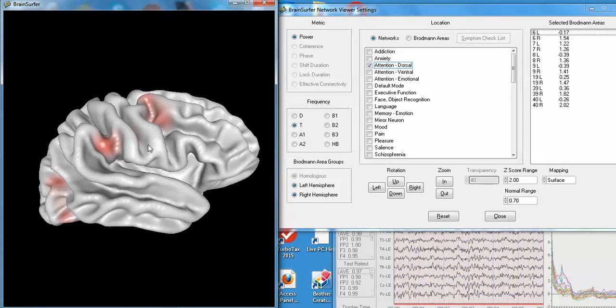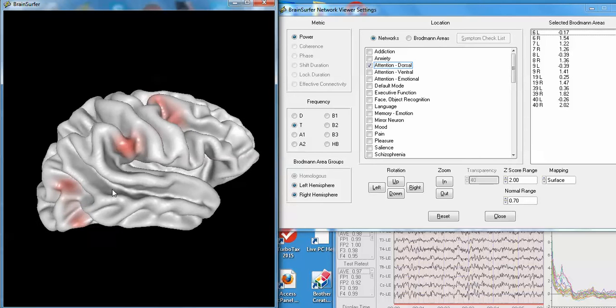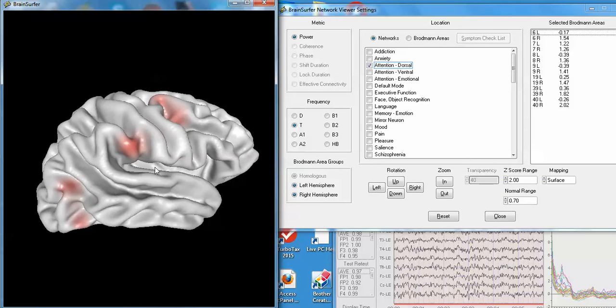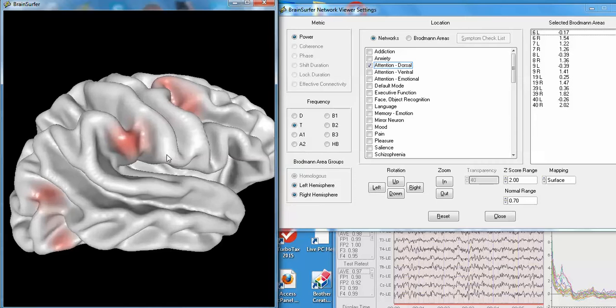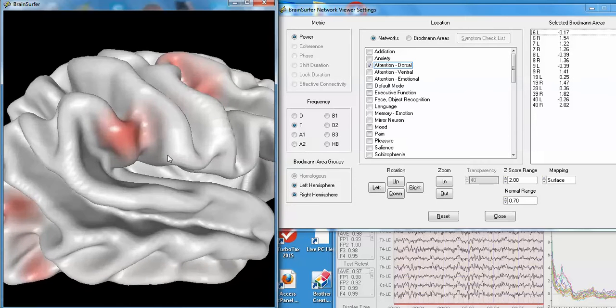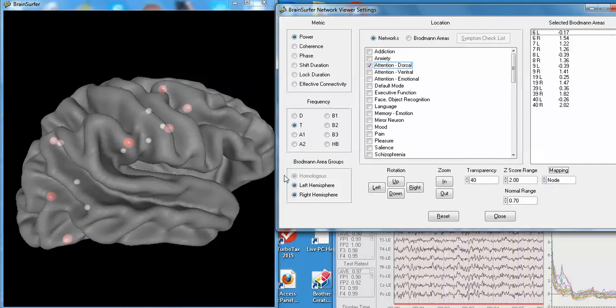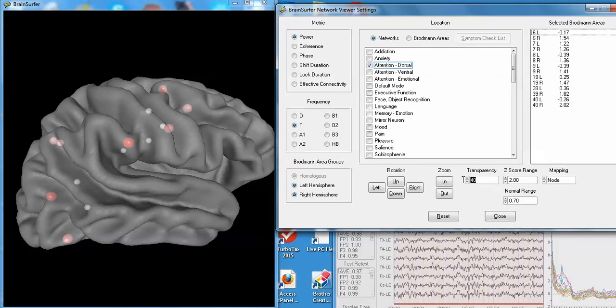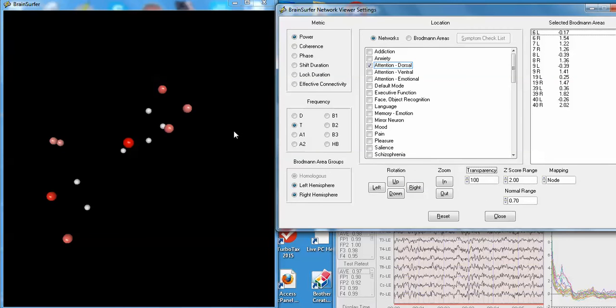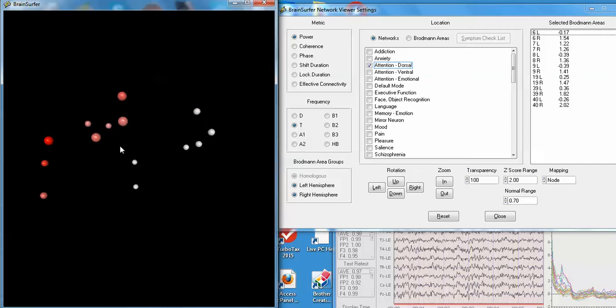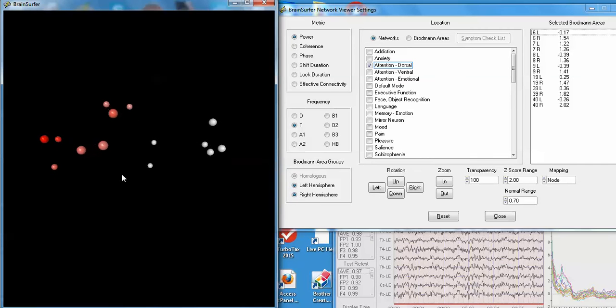From the surface, as a projection, you can see the z-scores, the deviation from normal. You can zoom in and zoom out. You can go back to the nodes and look at just the network itself by making the brain 100% transparent.